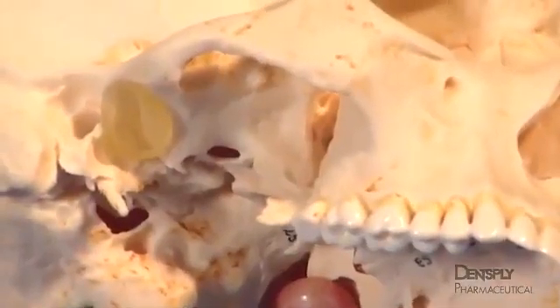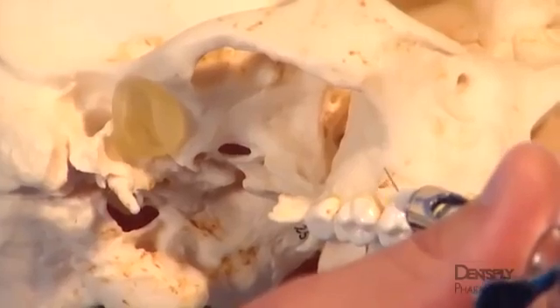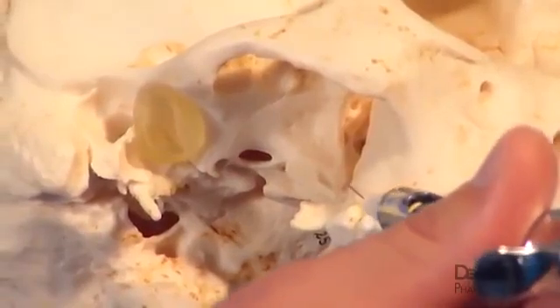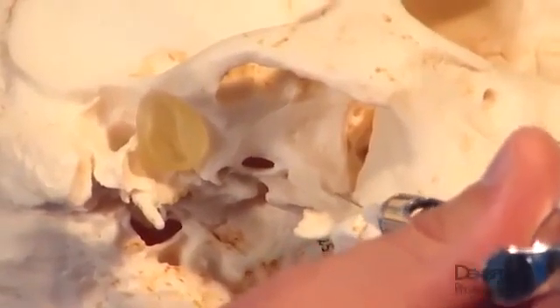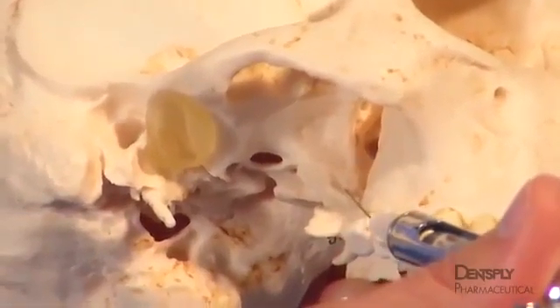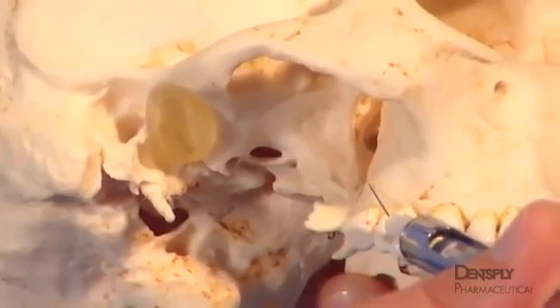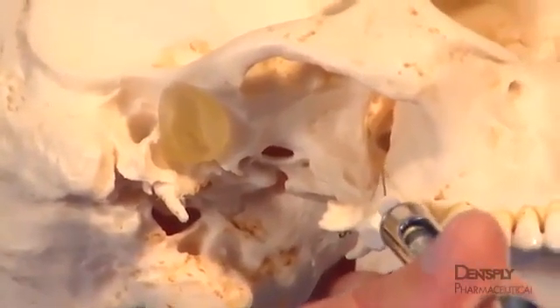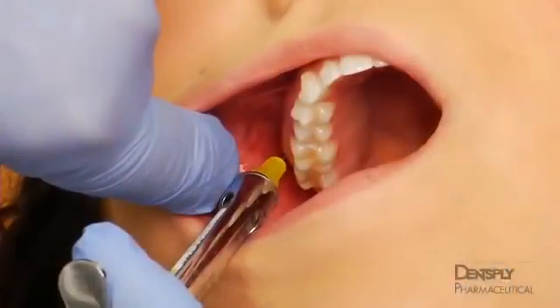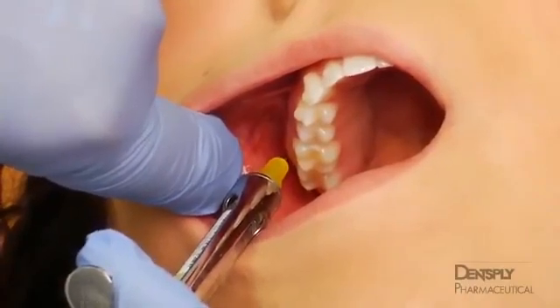Premature contact of bone requires that the needle be withdrawn before being reoriented to minimize the chances of hematoma formation. A positive stop against bone near the final depth of insertion probably means that the needle has impinged on the pterygoid plate. In this case, the needle should be withdrawn slightly, a negative aspiration obtained, and the anesthetic solution injected. Anesthesia will often be obtained because of medial spread of the solution. If it is not, re-injection along a slightly more medial pathway can then be performed.